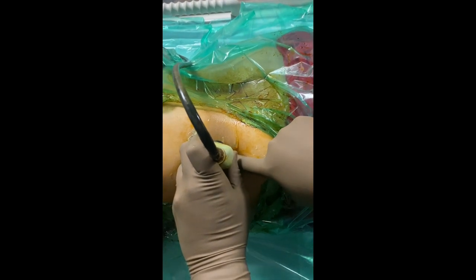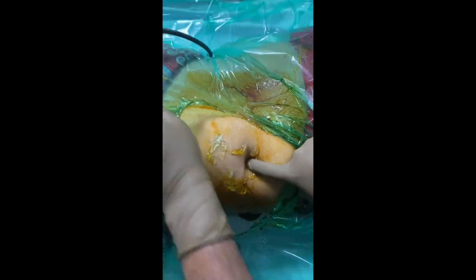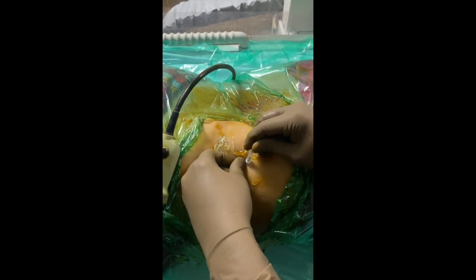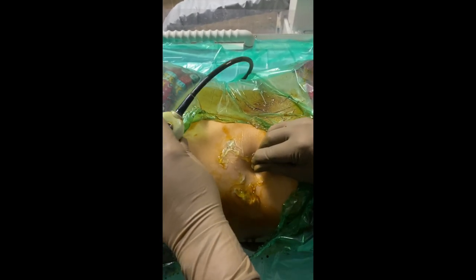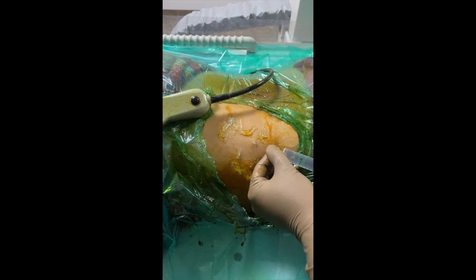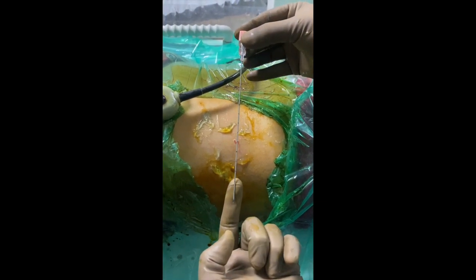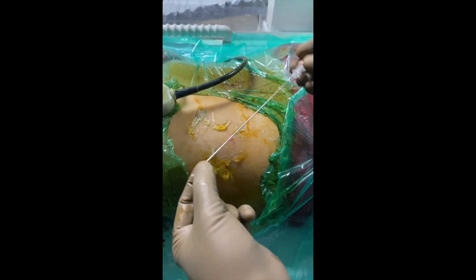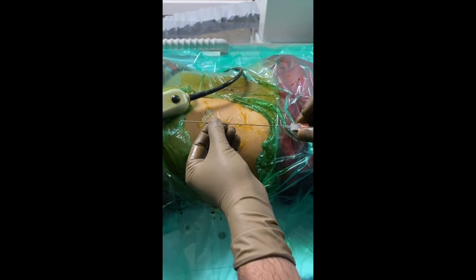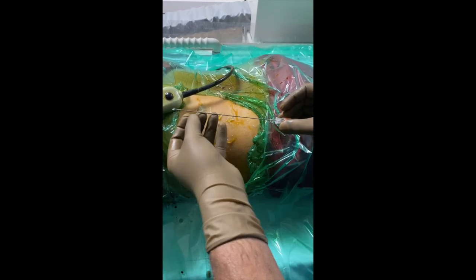After selecting the inferior calyx for puncture, the corresponding site on the skin surface is marked using a small syringe cap, pressing lightly to create a small impression on the skin. Local anesthesia is then injected at the site of entry. In view of the large perinephric hematoma, an 18-gauge Chiba needle was chosen, as it needs to go deep through the hematoma to reach the calyx.